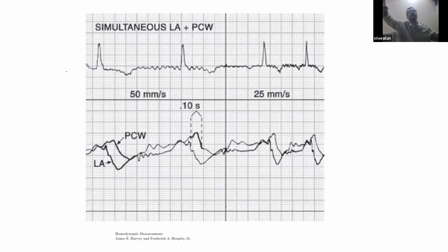There is time lag because for the wedge your catheter is in the pulmonary circulation and you are checking a pressure in the left atrium. There is a distance. So this time lag has a problem. Yes, time lag has its problem. And I'm going to show you, even in the interpretation and analysis, this problem might impose erroneous consideration of gradients and stuff like that. Okay?